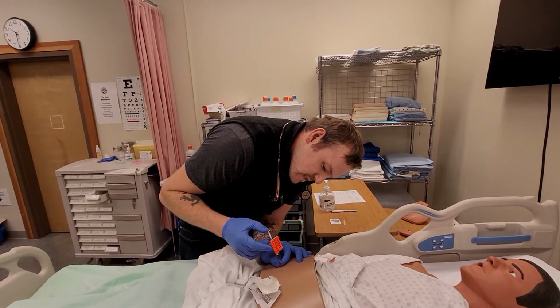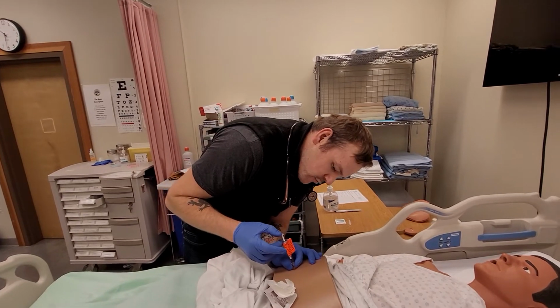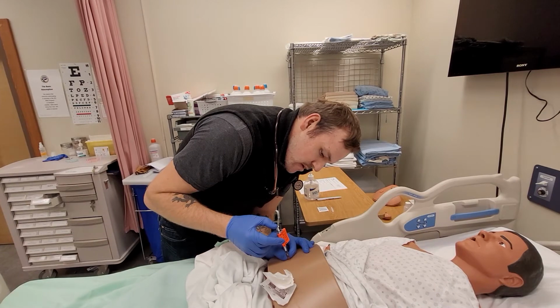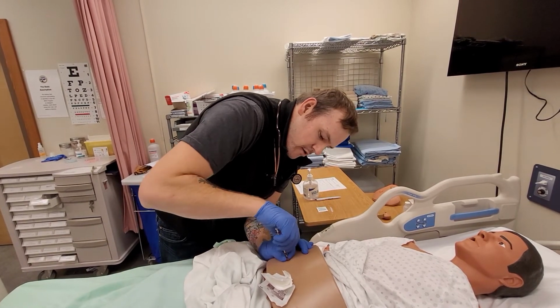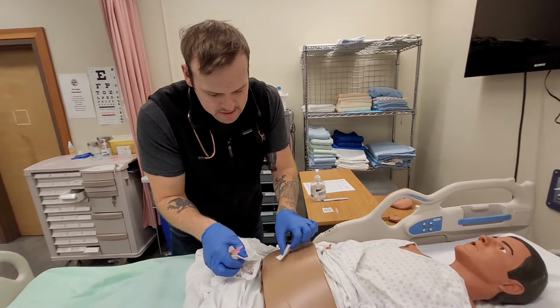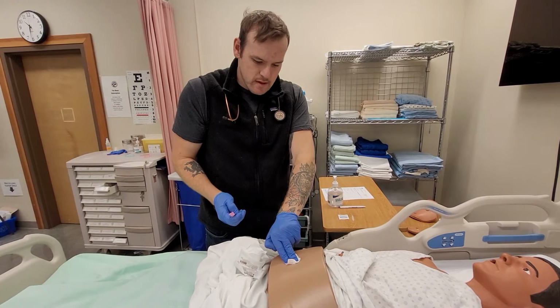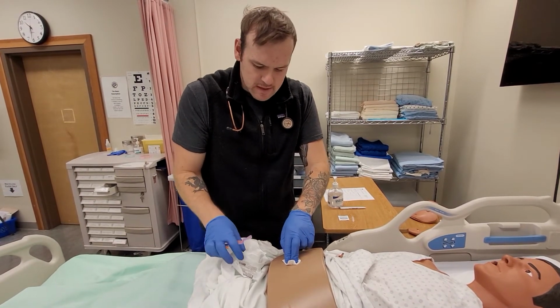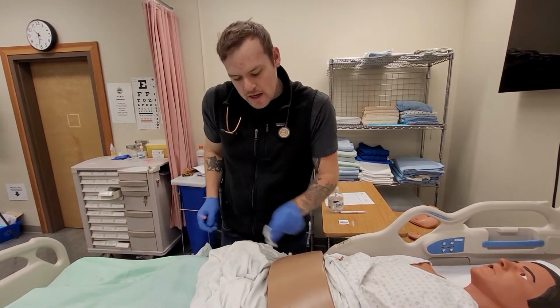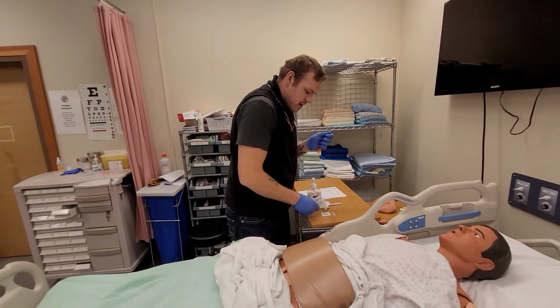So we're going to inject this medication here at that correct rate. Perfect. I'm going to remove quickly and cap the needle, and then we're just going to apply pressure with the gauze to stop any bleeding. So, Mr. Wilson, no bleeding. I'm going to return your bed back to a safe height. I've got my sharp here.